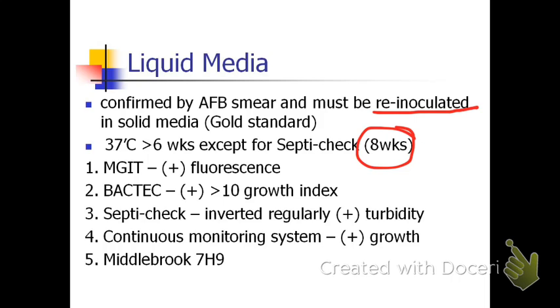So these are the different kinds of the liquid media. The MGIT, the Bactec, Septicek, continuous monitoring system, and the Middlebrook 7H9. By the way, the Middlebrook 7H10 and 7H11 are examples of agar-based media. Okay, they are not liquid media.